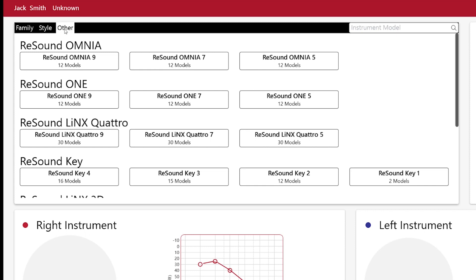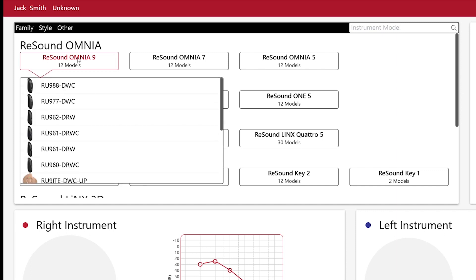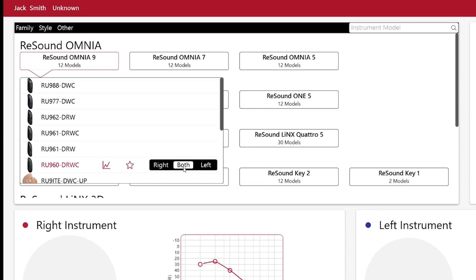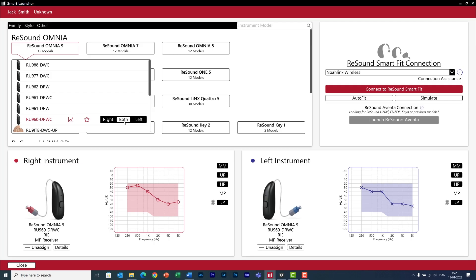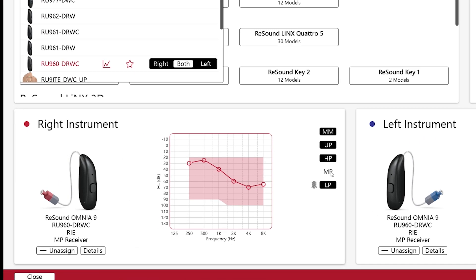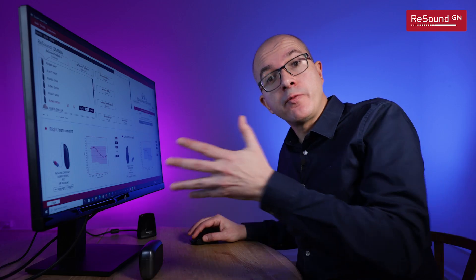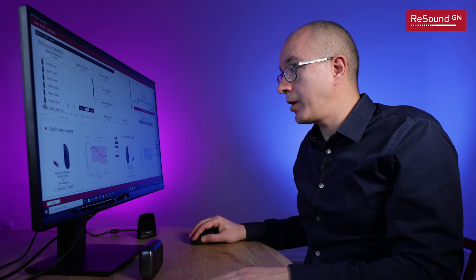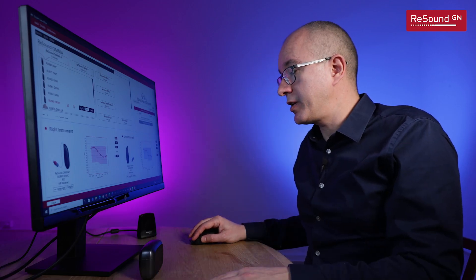In our case the model I want to fit is the ReSound Omnia 960, it's this one here, so I can assign this hearing aid to both ears and now here they appear. And here I have all my different power levels of the receivers and the one that the software recommends is indicated with this ribbon icon that you see here.